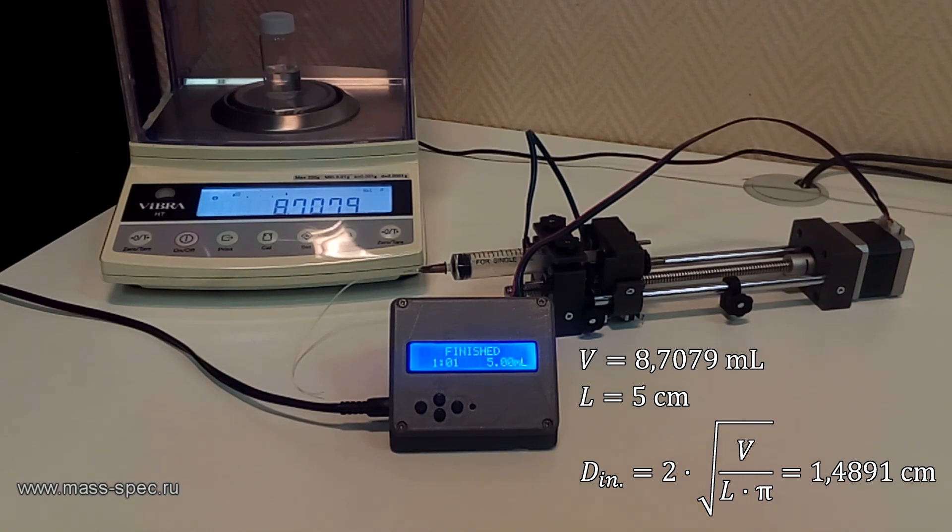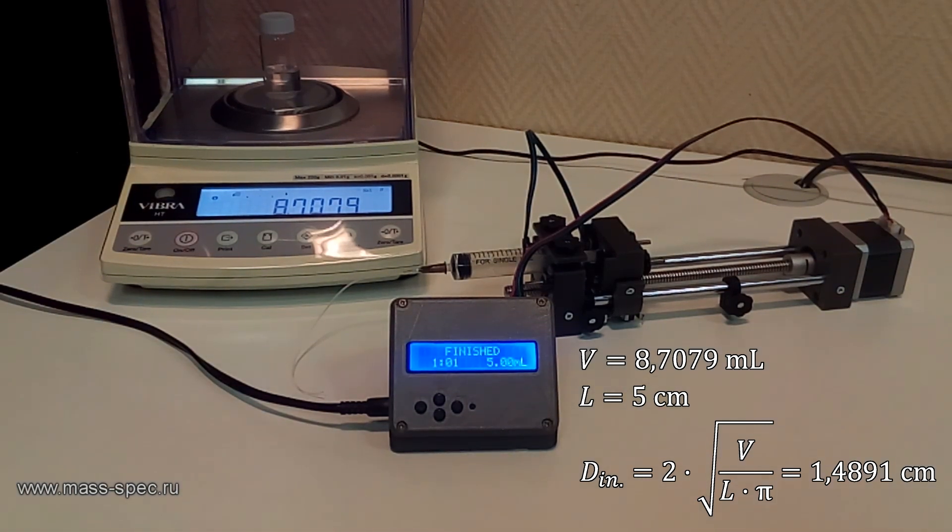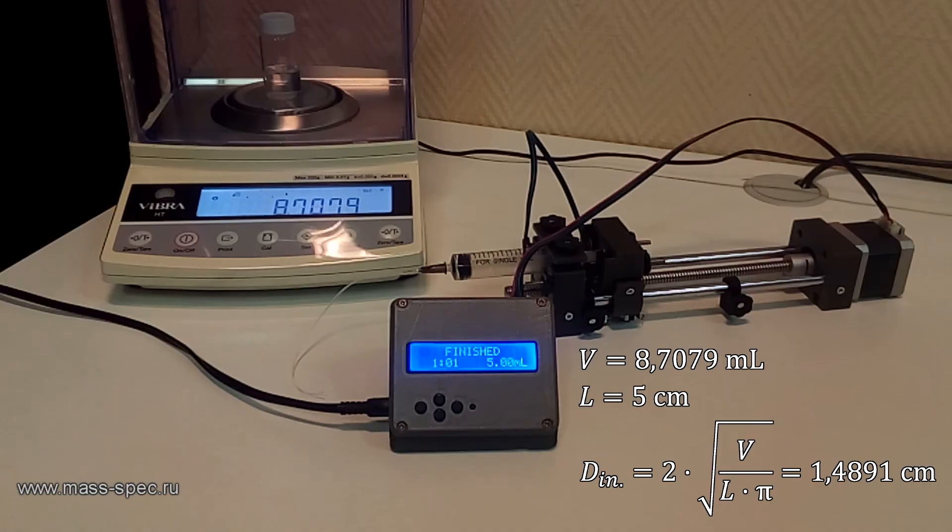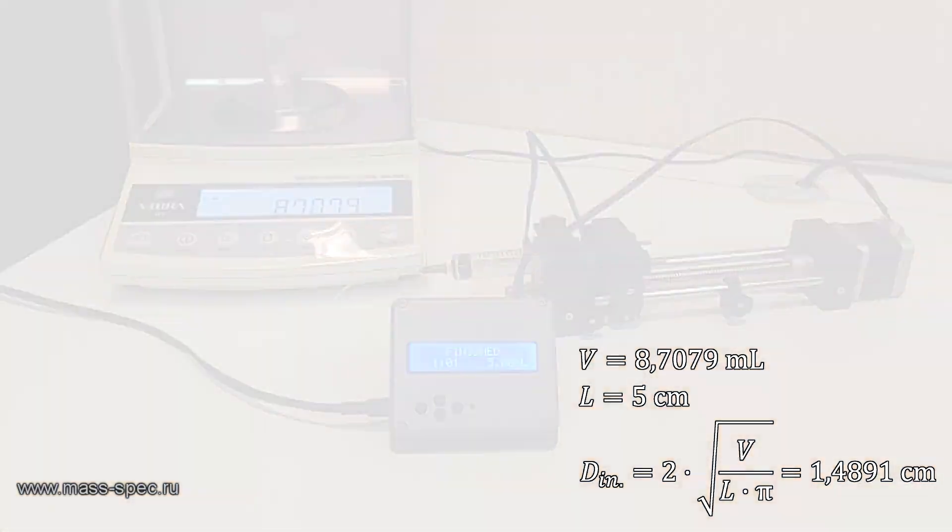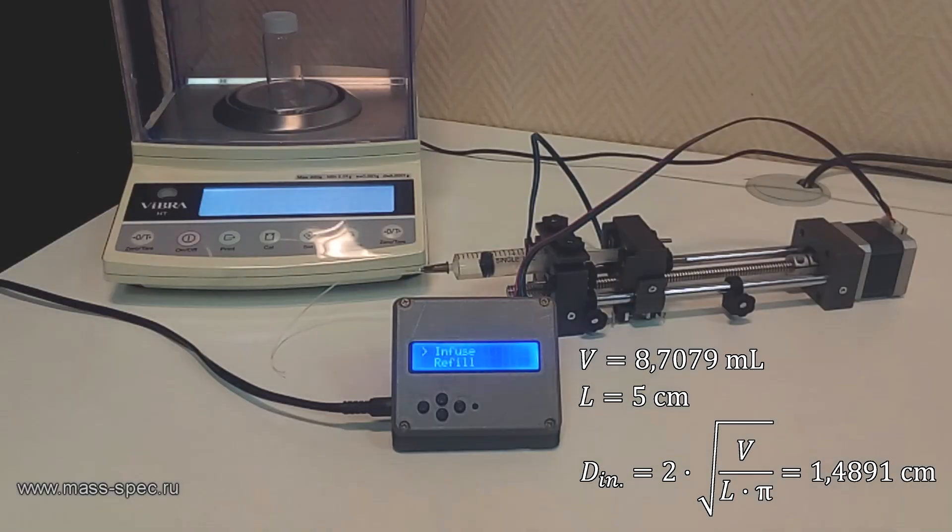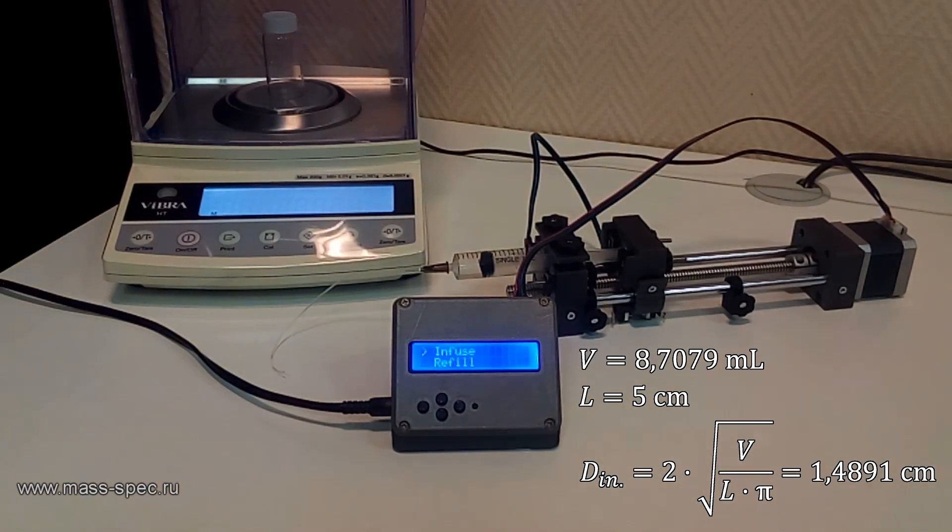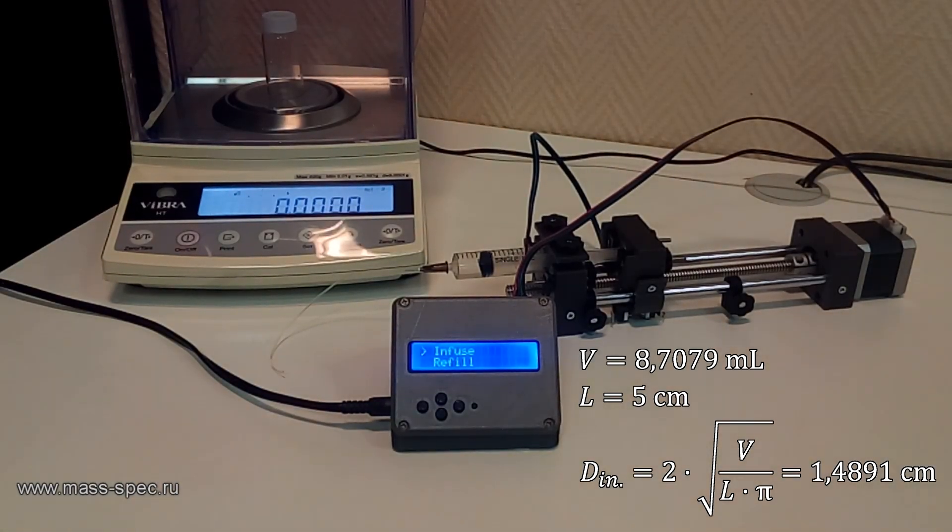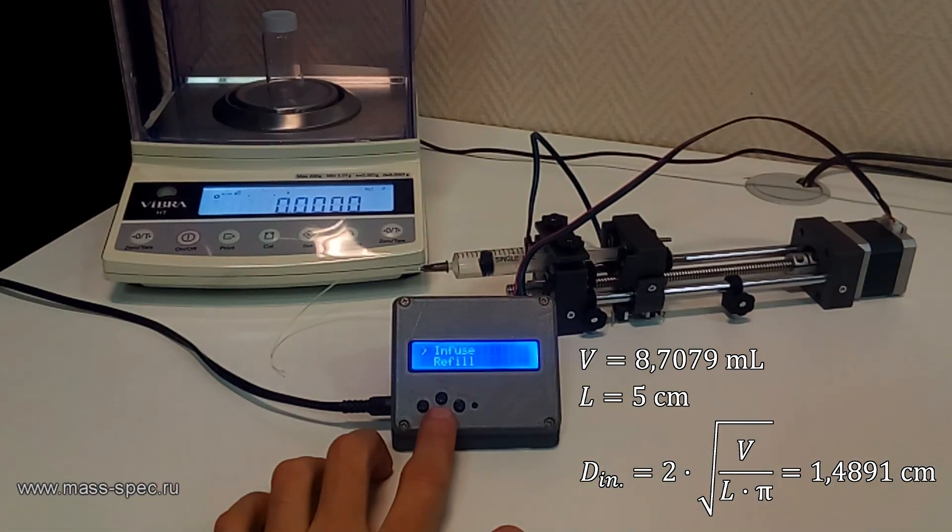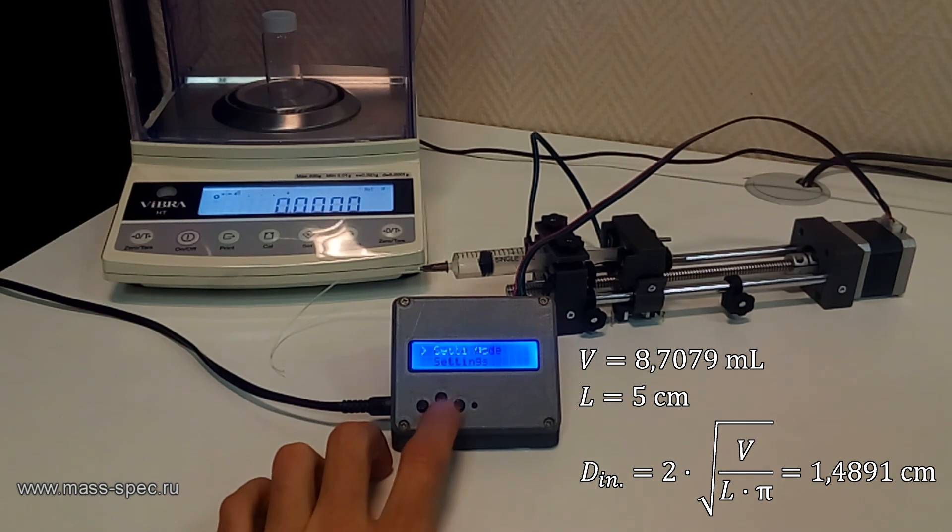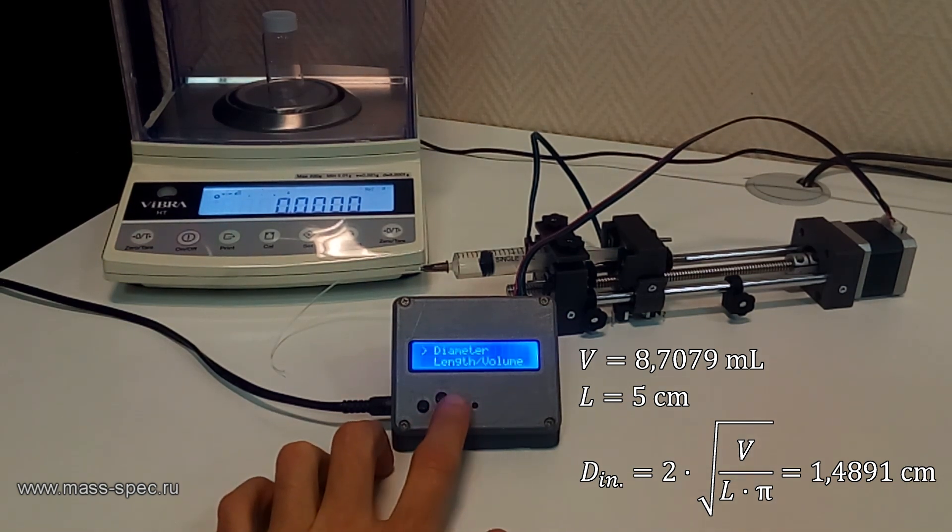8.7079 milliliters of water were dispensed. The inner diameter can be calculated using the following equation. It is equal to 14.891 millimeters.